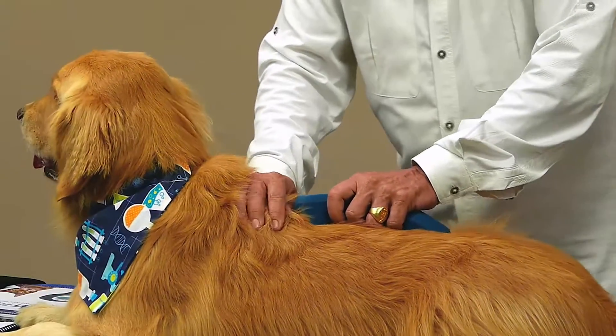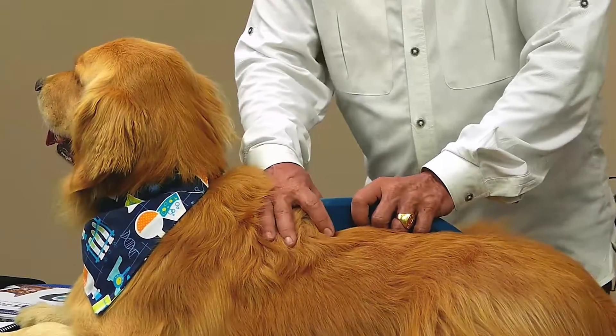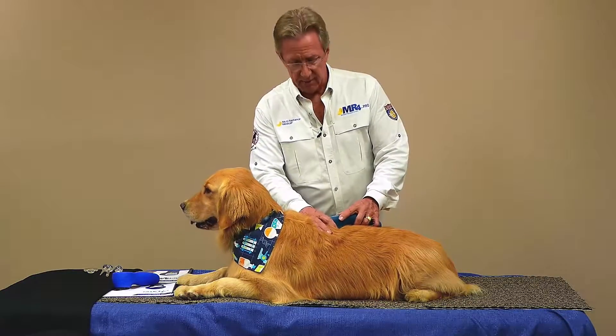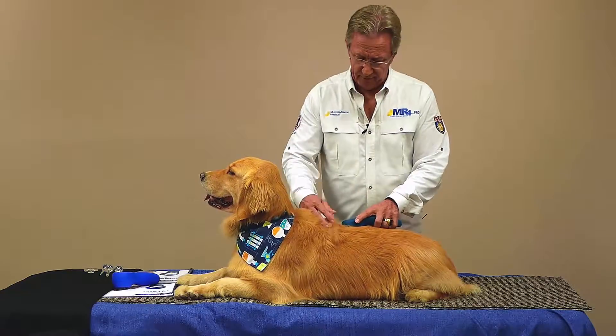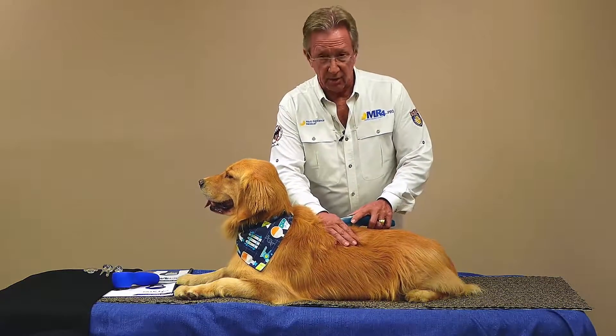This is so much easier than a Class 4 because we have no worries about overheating tissue. I can hold it in one spot — it's because the duration of the pulses is nanoseconds, 20 to 200 nanoseconds. No heat buildup at all, so the animal stays really nice and comfortable. You'll never see us using a squirt bottle to keep it cool. It just stays nice and comfortable for them.